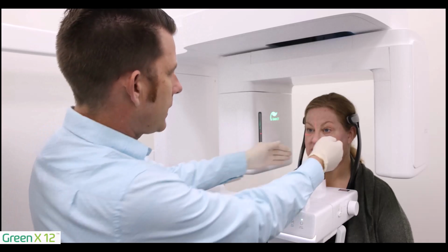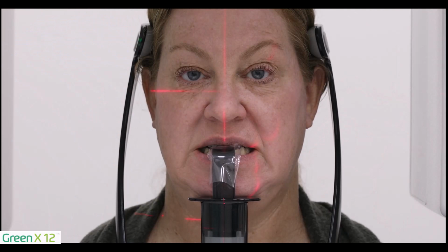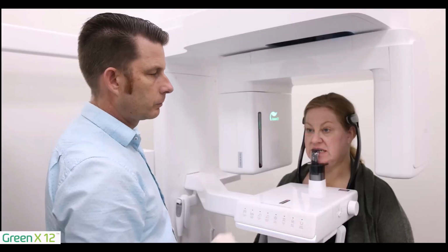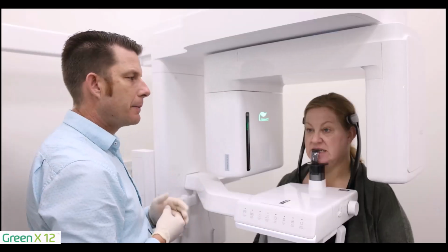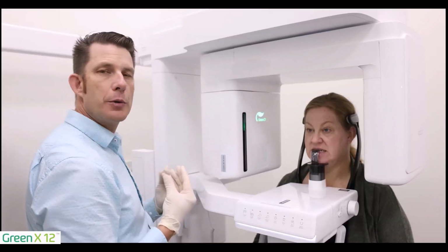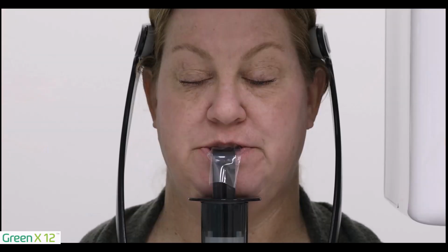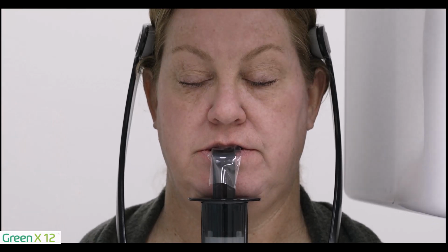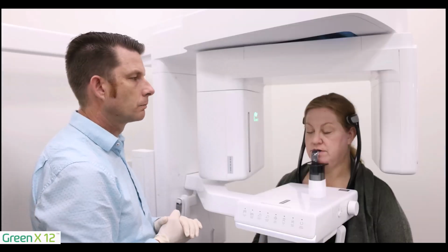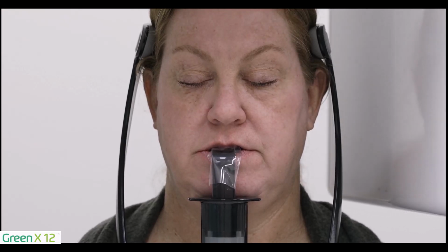Next, I'm going to double check and make sure the patient's lined up center. I'm going to go ahead and select my ready return. The system is moving into image capturing position. Please wait. When we're positioning for our panoramic image, I'm going to have my patient close their eyes, close their lips around the bite stick, and also swallow and keep the tongue flat to the roof of the mouth. The system is ready to capture an image. Please close your eyes until image capturing is complete.